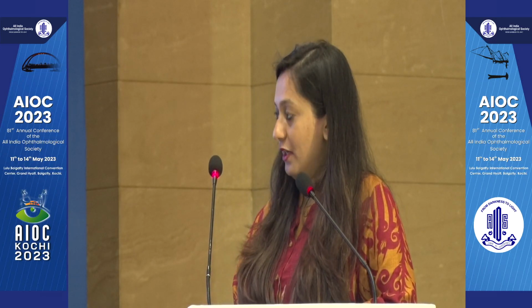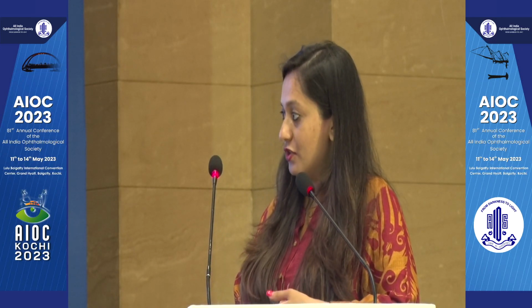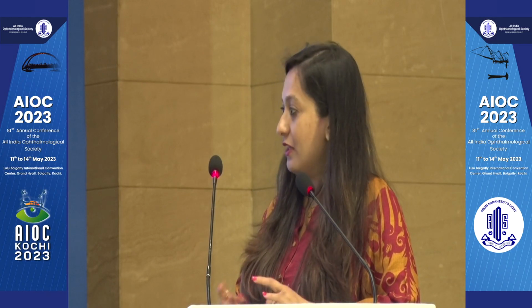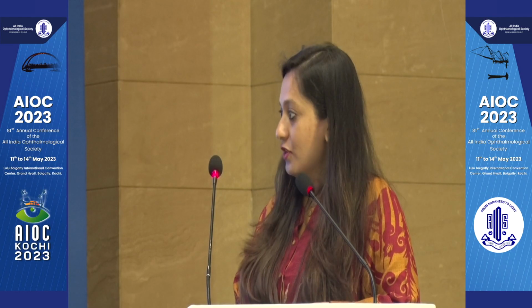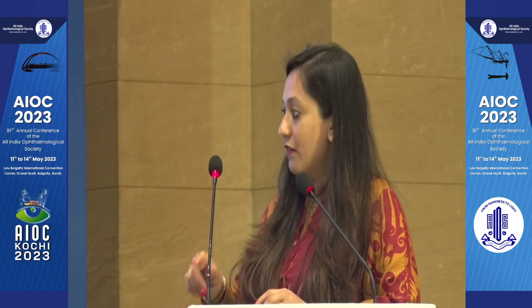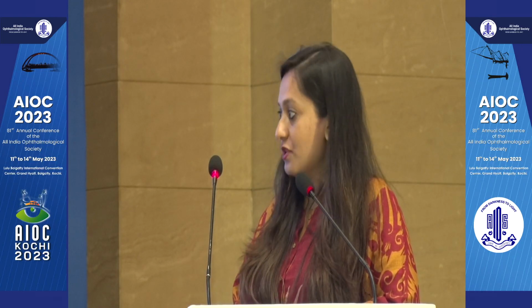So it depends. Again, the history comes into play, whether they have undergone a LASIK surgery or whether they have undergone a PRK. A lot of these patients who are coming here have either undergone RKs or PRKs. So there you will opt for a surface regularization. But if they have a history of LASIK surgery, if you have an OCT where you can see the flap margins, if the flaps are even and not very irregular, you can always go for a flap lift as well. But history is very important. You have to have your OCTs in hand to decide, and then you proceed with it.